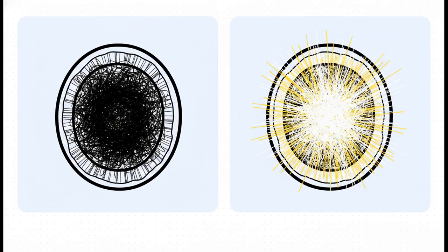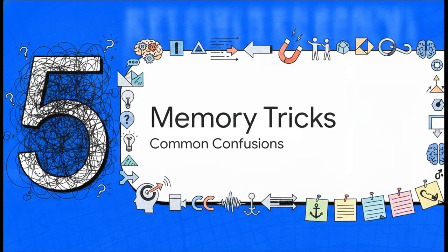Because gradient echo is lightning fast and uses a continuous inflow of relaxed spins, the blood appears brilliantly bright against the darker heart muscle. That bright blood contrast is exactly why gradient echo variants rule the world of cardiac cine imaging. Section 5. Memory tricks and common confusions.